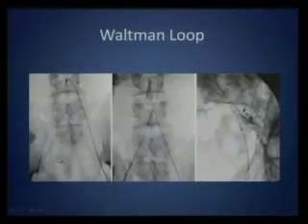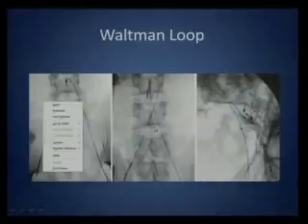So you just put any curved catheter like a Cobra, you pass your wire here, this much of catheter inside, and then you spin the catheter up. As you're spinning the catheter up, it forms this shape, and you can pull it down into the iliac artery on the same side, internal iliac.